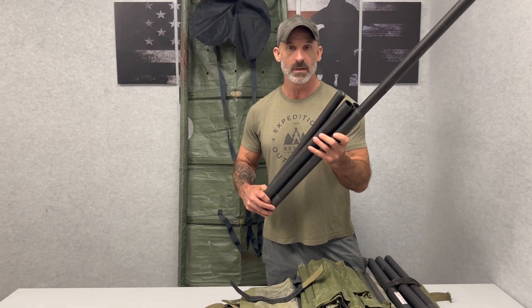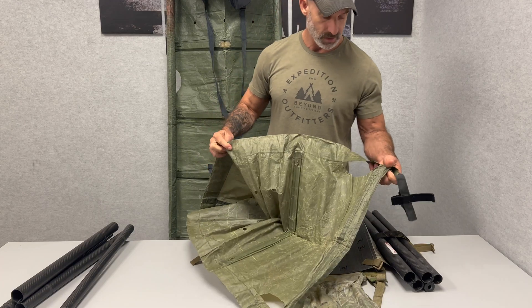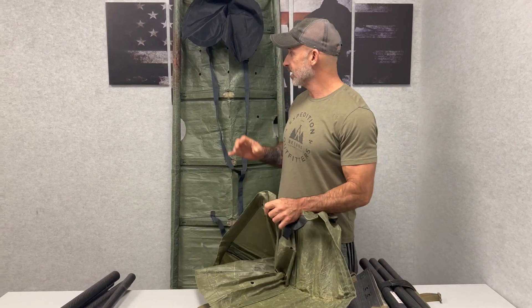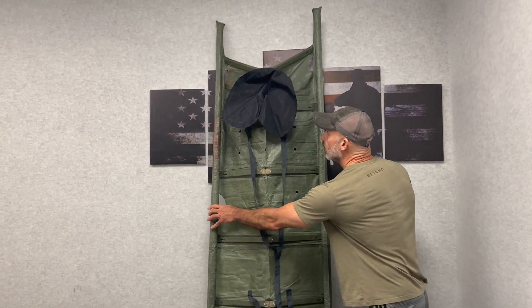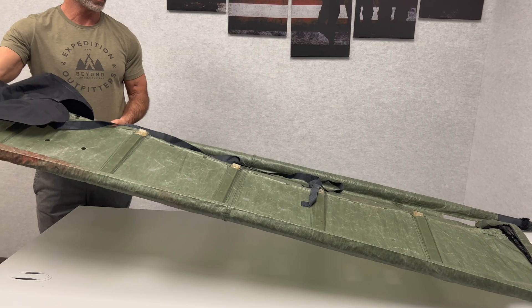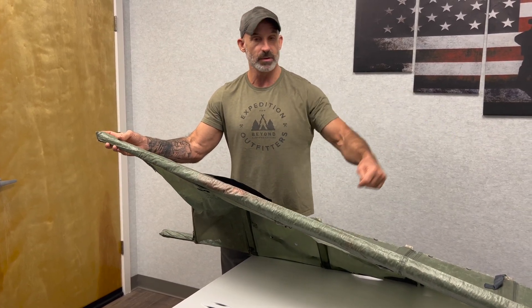Once I have the tent poles extended, I'm simply going to find the end and slide the poles through the openings at the ends of the R-Lift, sliding all the way in, and then put the end cap on top. I end up with a fully rigid stretcher. It only took about a minute to put together — all I did was slide the poles through the bottom end of the R-Lift all the way to the top, with an end cap so it doesn't go any further.